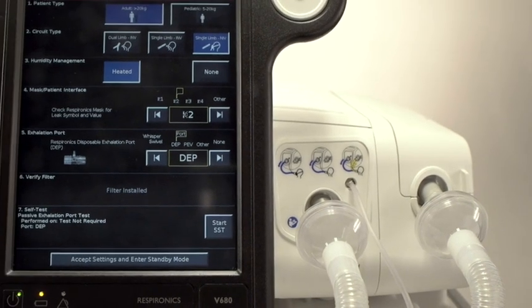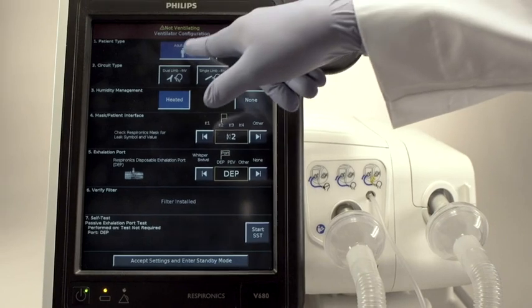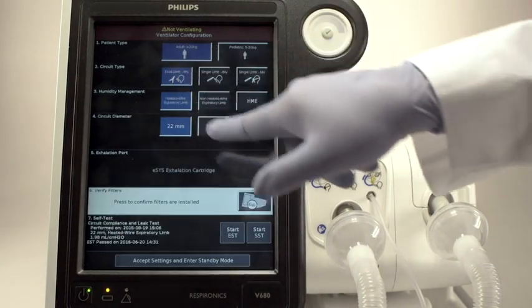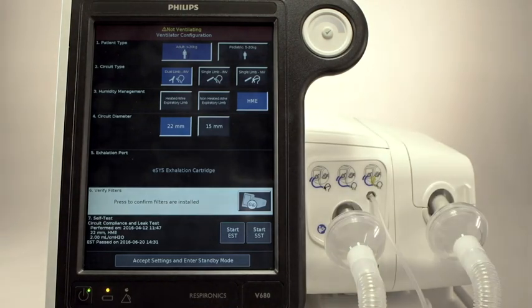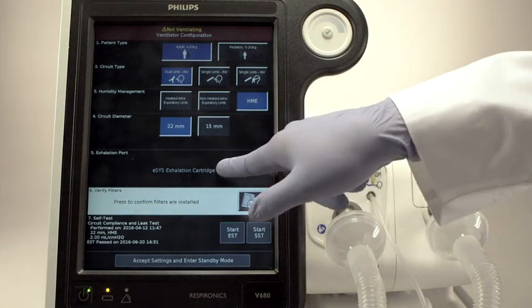This time, let's select Adult Dual-Limb Invasive Ventilation, HME, and a 22-millimeter circuit. Touch the screen button to verify the ESIS cartridge is installed and that both filters are attached.